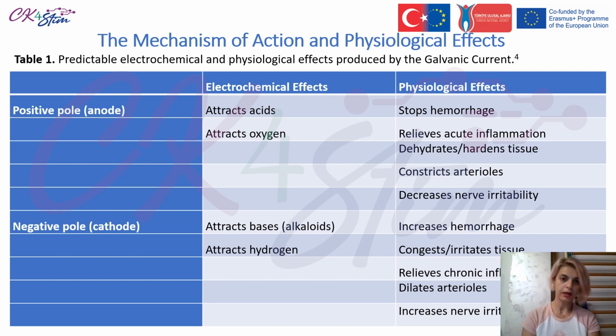The smaller active pad yields a more pronounced polar effect due to its higher current density, compared to the larger dispersive pad.